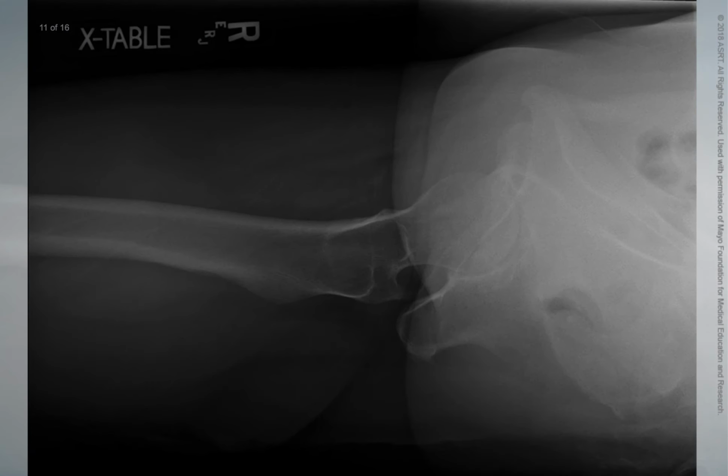The following quality criteria should be used to determine if a cross-table lateral hip radiograph has been produced with proper positioning and technical factors. Collimation does not obscure relevant anatomy. The hip joint and acetabulum are displayed, and the femoral neck appears without overlap from the greater trochanter. A small portion of the lesser trochanter is visible on the posterior surface of the femur, and a small portion of the greater trochanter is visible on the anterior and posterior surface of the proximal femur with proper femur inversion.